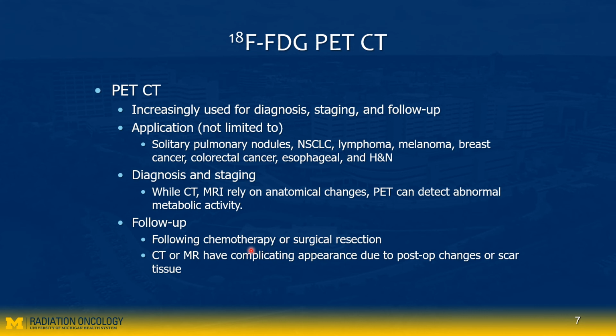CT or MRI have a complicated appearance because of these changes from chemo or surgery. However, PET will provide this high concentration wherever the tumor is. So it's very unique information that PET can only provide.